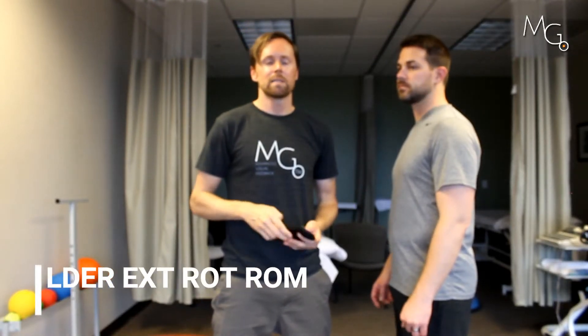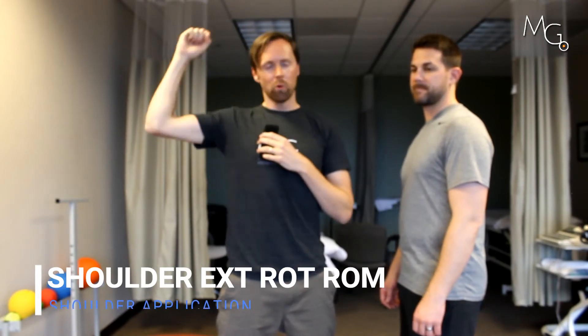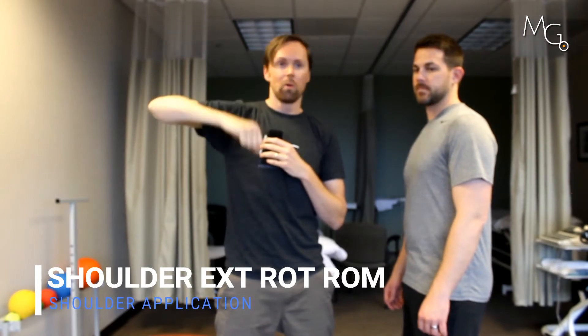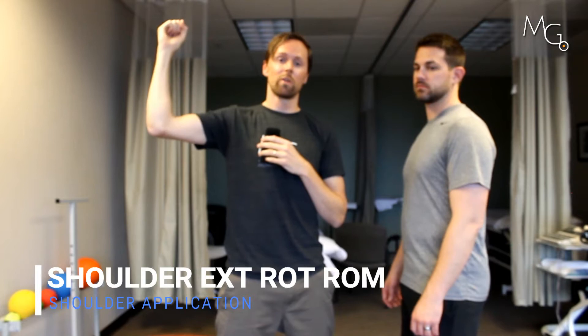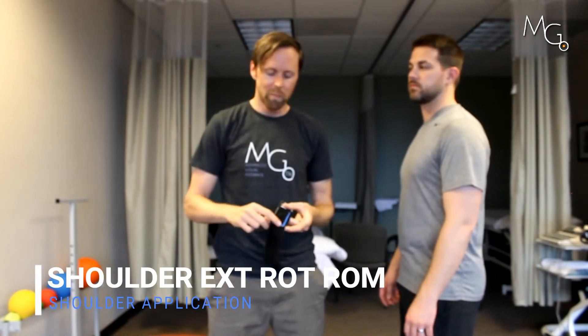In this video we're going to look at external rotation range of motion. This could apply if you're working on someone after a labral repair of their shoulder and you don't want them to go past a certain point, or if you're trying to maximize that external rotation and encourage someone to move as far as they can. We're going to use the smallest strap we have and the parallel mount.